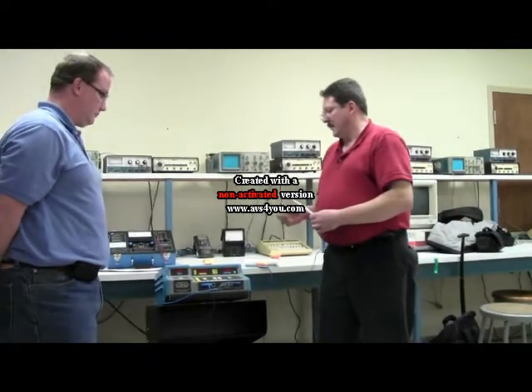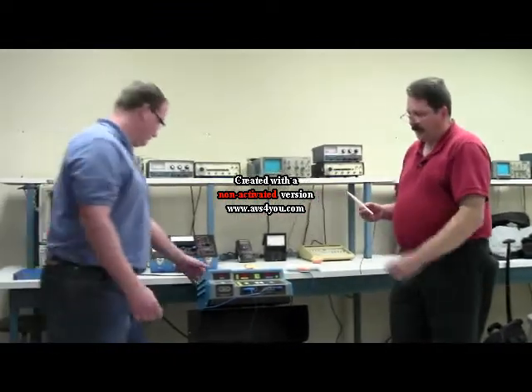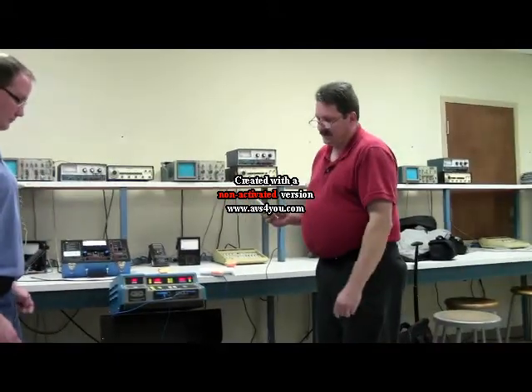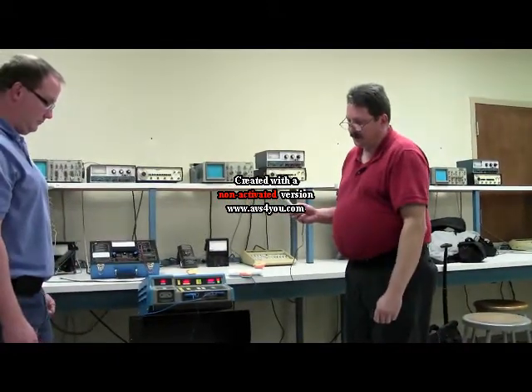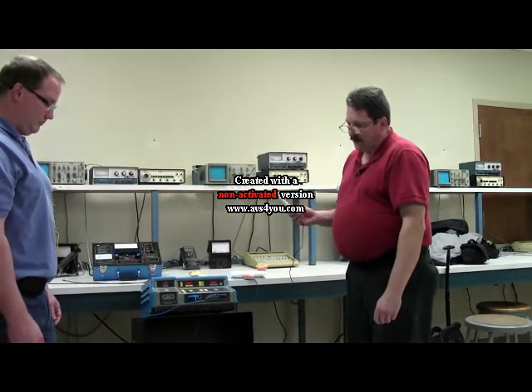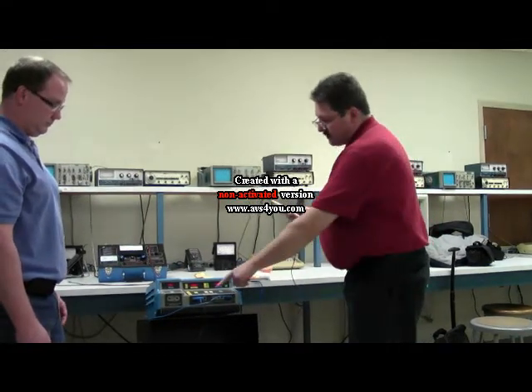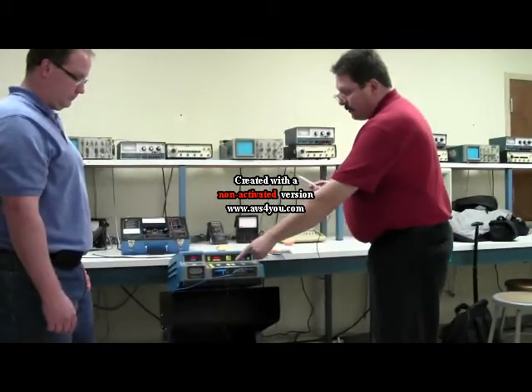I'll have Ted turn on the unit. As you can hear the beep noise and the LED displays are turning on, and it starts out in the standby mode.